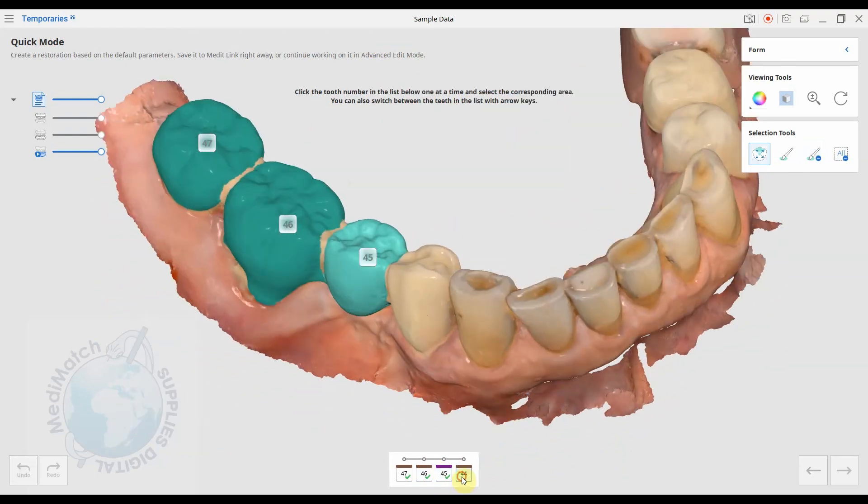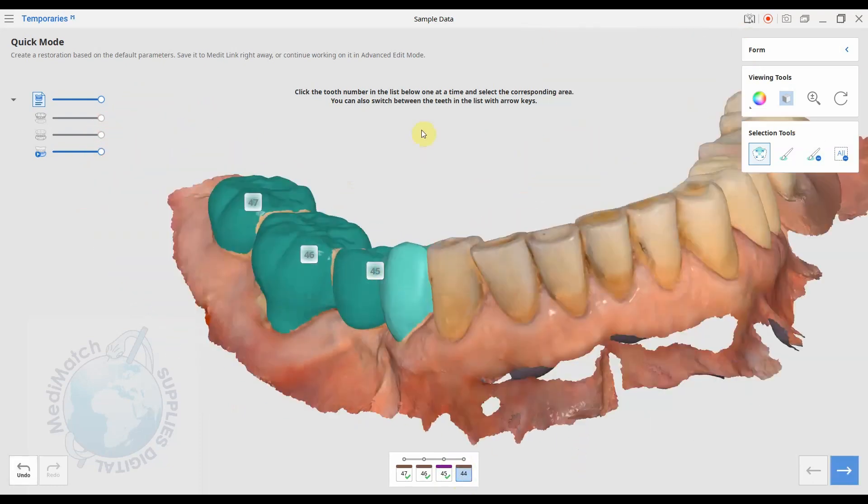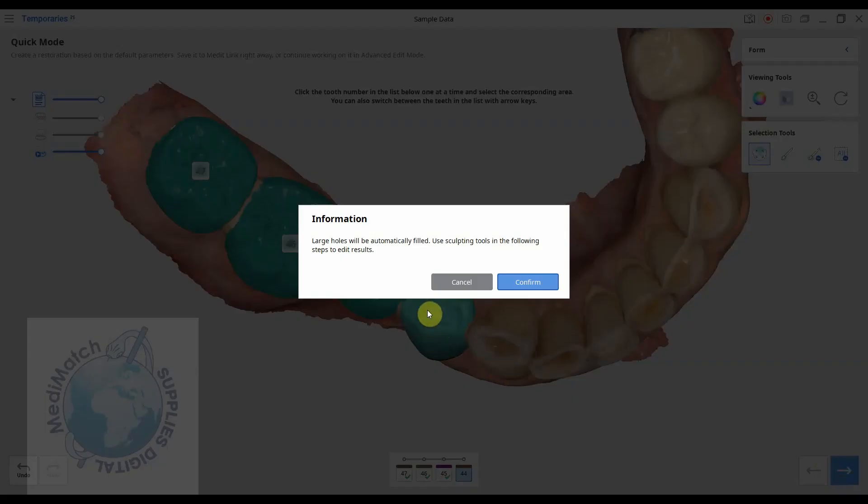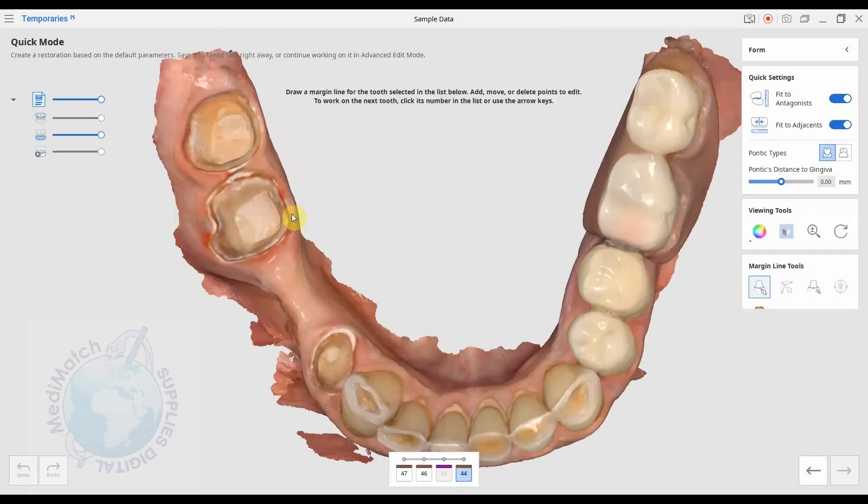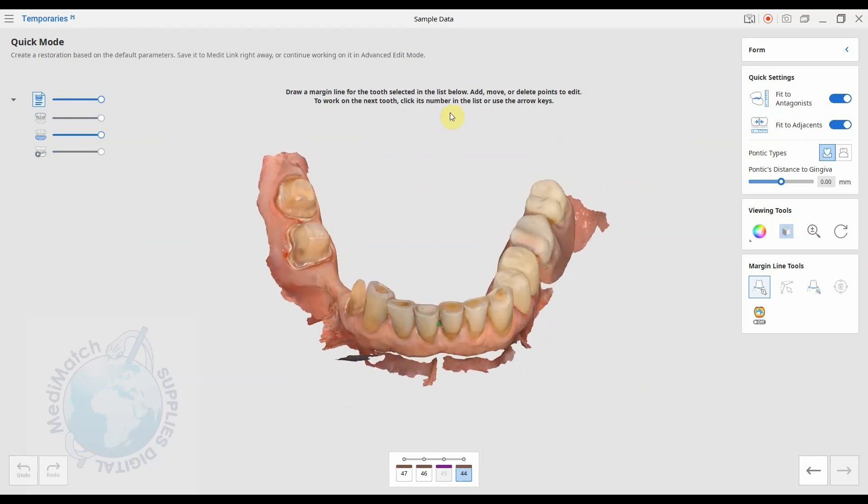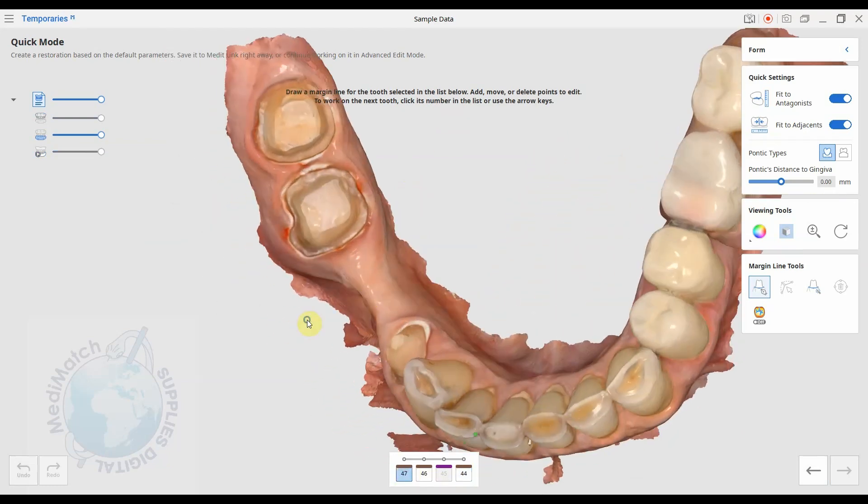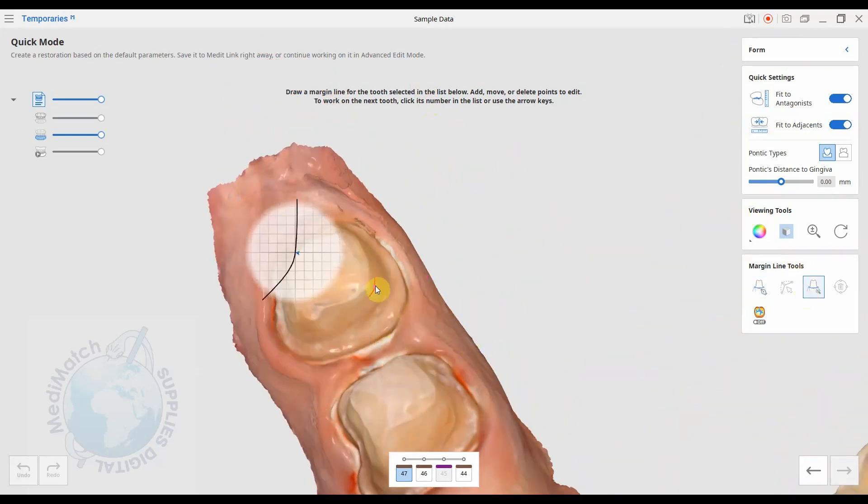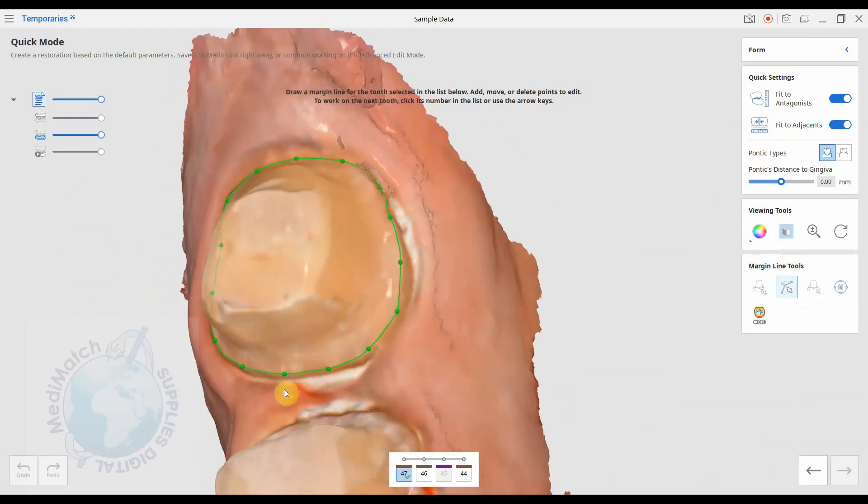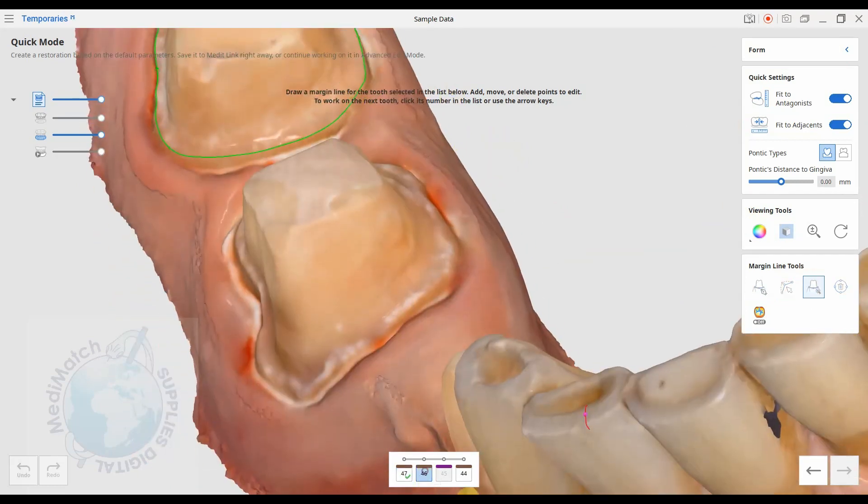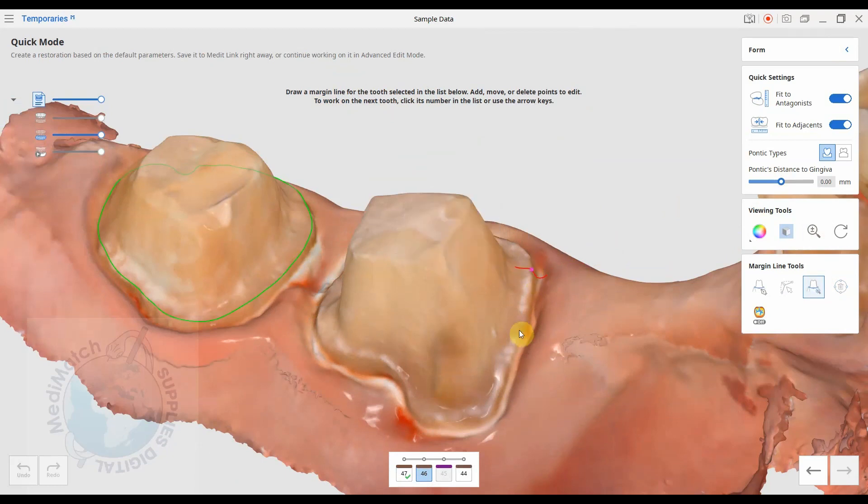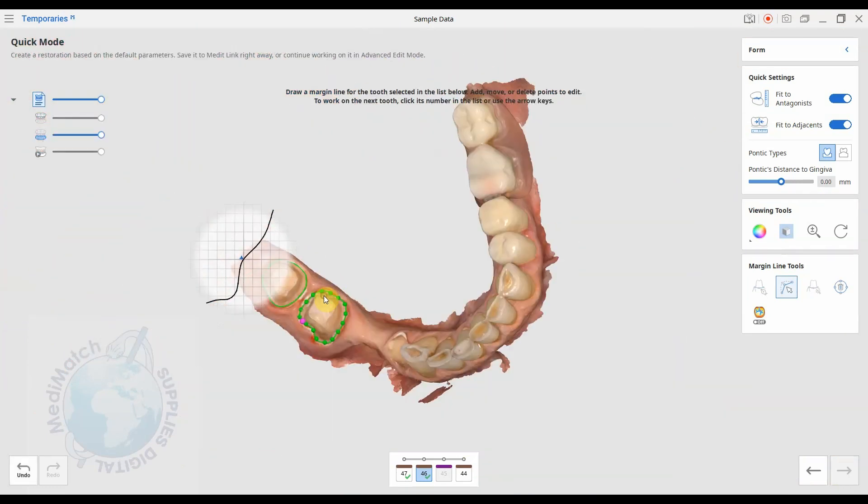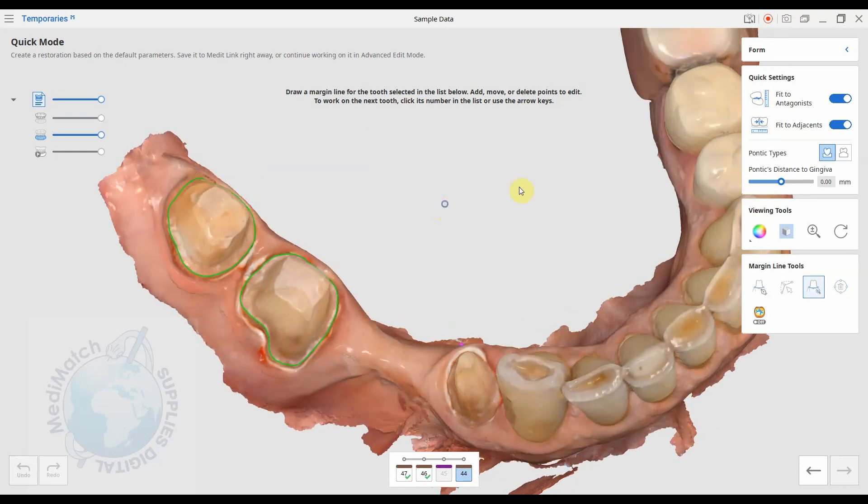And then the four. So again we can click like this, fine, and press next. So it says large holes will be automatically filled and we can use the sculpting tools in the following steps to edit these results. Press continue. Okay, so we're now going to go back through the numbers down here and we're going to define the margin lines. So we'll try and do an automatic margin line on these. I'm not sure if it'll pick it up, but we can try. Yeah, it's done a pretty good job there. We'll press on the next tooth. You can use the little 2D drawing to help visualize the angle you're clicking on. Again, that's not too bad. We might nudge this one in slightly.